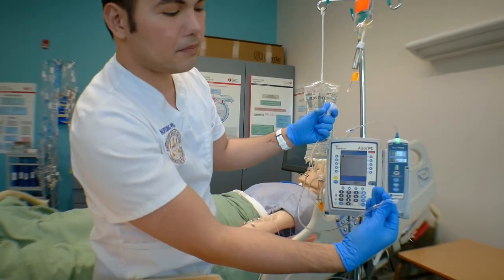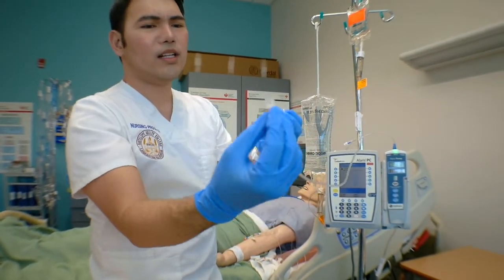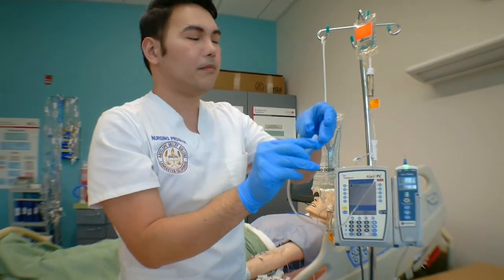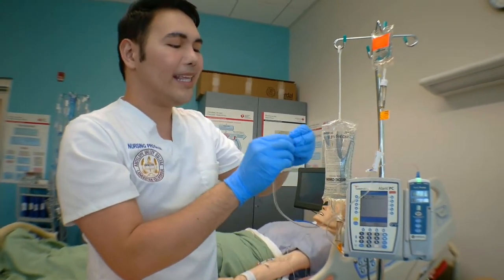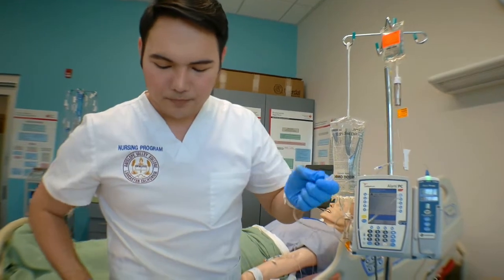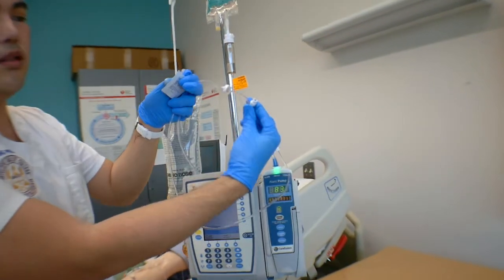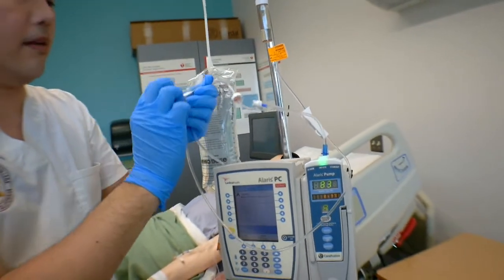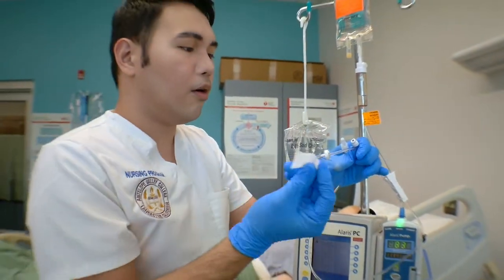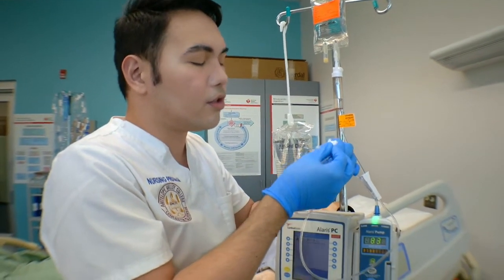Prime it until you see the tip, or like until you see a drop on the end of your tube. Since it's antibiotic, you don't want to waste a lot of it because you want the whole medication to go to your patient. In any case that you see bubbles, I'm gonna show you how to troubleshoot that in a bit, okay? So we're gonna go ahead and find the port nearest to the secondary, which is this one. And we're gonna go and swab it. So like I said, anything you infuse to the port or any ports, whether secondary or primary ports, you always swab it with alcohol before. So 15 seconds, make sure you have friction.